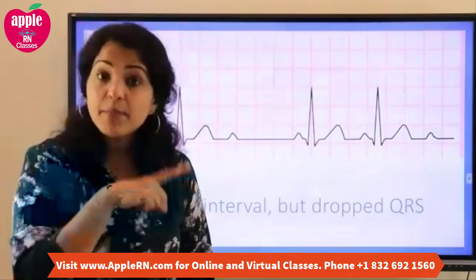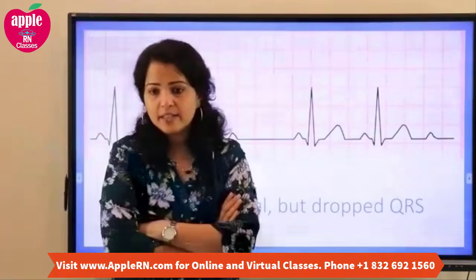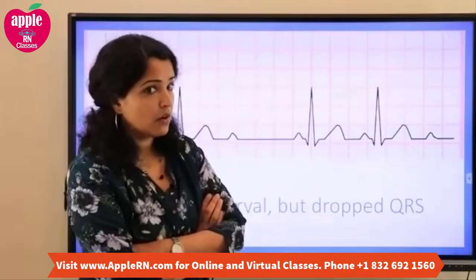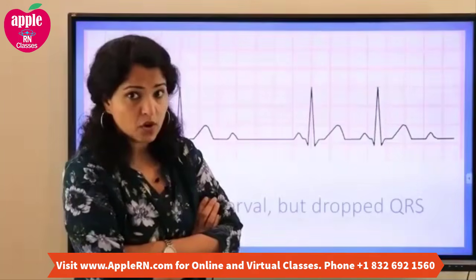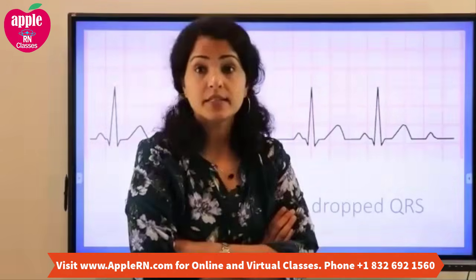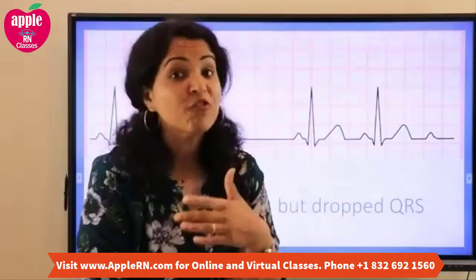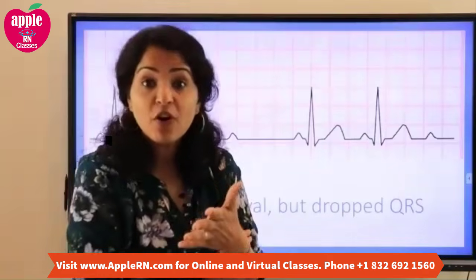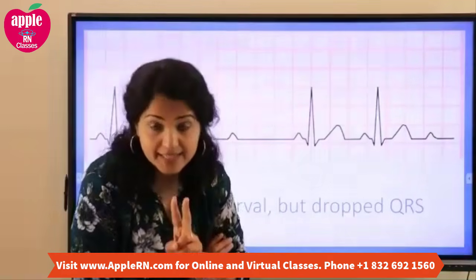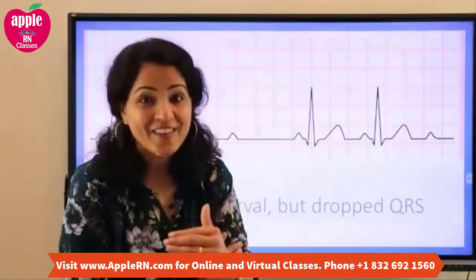Because in type 1, we had enough warning sign. The wife was waiting there and she was like, today he comes at 5. Very good. Tomorrow he's 6. Oh, that's not a problem. So there's something wrong. Then the next day he's coming at 7. Oh, that's even worse. And then the next day he doesn't come. That's really bad. So we had enough warning sign before there was a drop in QRS. That's second degree type 1. The PR interval gets longer and longer and longer.